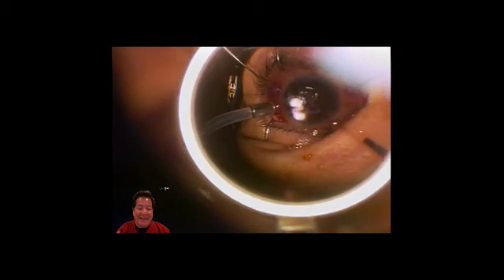But what's really unique about the 27-gauge system is that it operates at 7,500 cuts a minute compared to the 25-gauge system, which right now is only 5,000 cuts a minute. That means it's actually almost impossible for me to pull on the vitreous and thereby exert force on the retina. Huge difference. It means that you cannot really ever pull on the vitreous. So that means I have to move my instruments to follow the vitreous. What it means to the patient is highly unlikely that you can create a retinal tear, or less likely to create a retinal tear with 27-gauge, mainly because you can't be pulling on the retina.